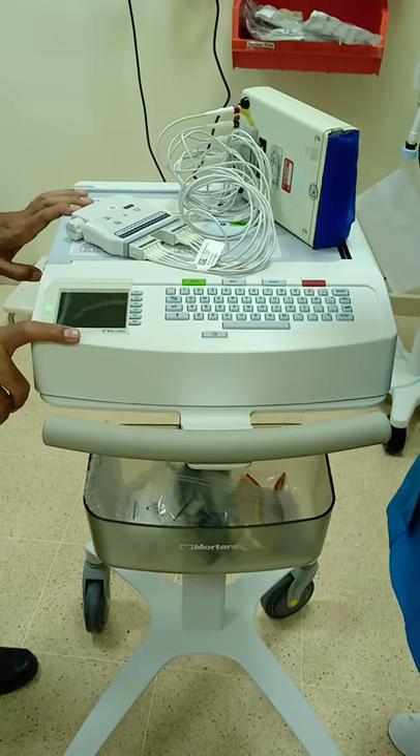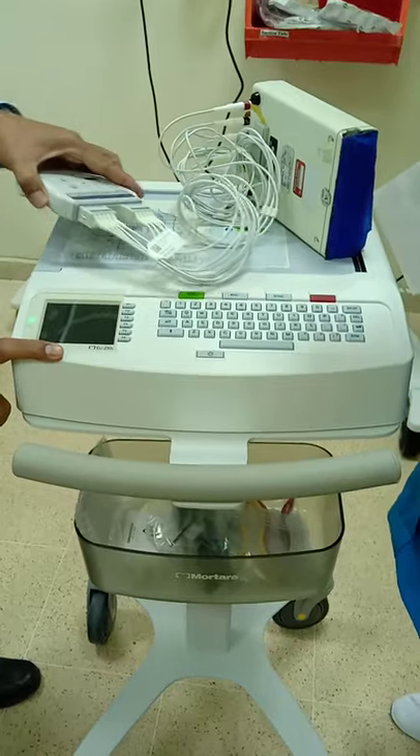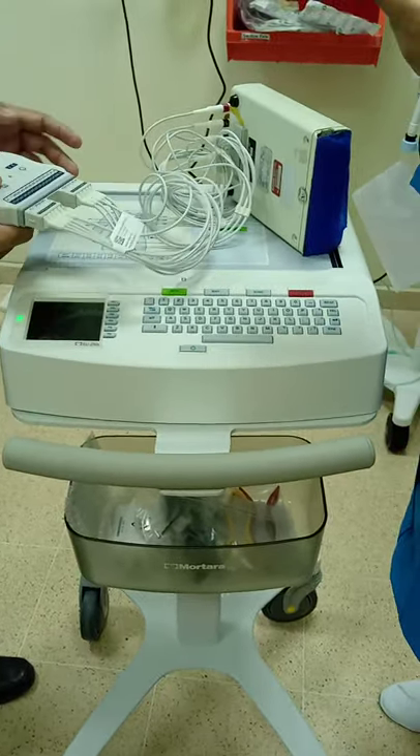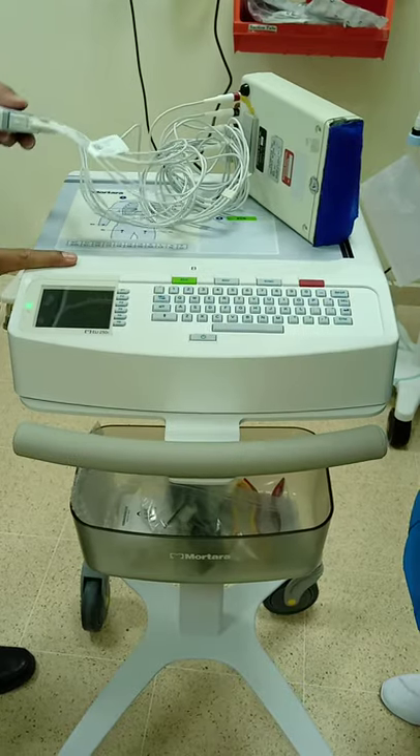This is a machine with A4 size paper. One difference from the other machine is that this is wireless, so there is no need to connect a cable to the machine.